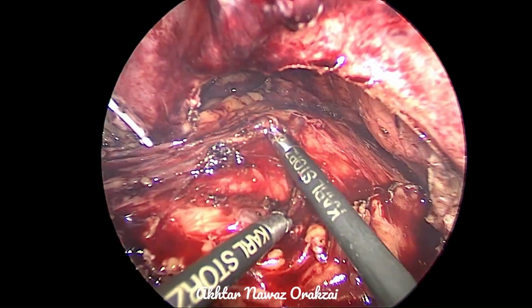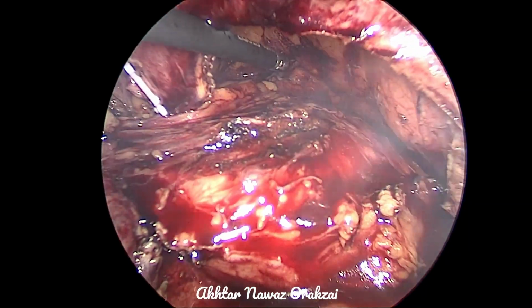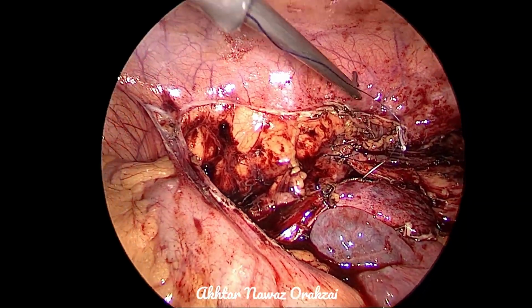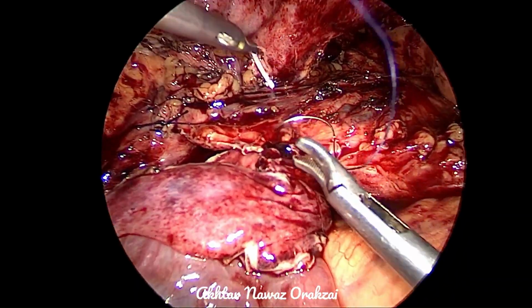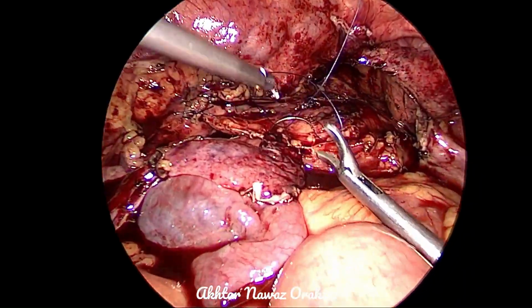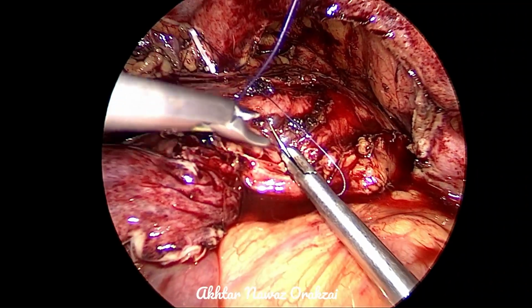tunnel. It is not really important to make a submucosal tunnel in adults, and that too especially in the ladies, because females usually have low pressure bladders, and the reflux does not matter in adults, number 2.